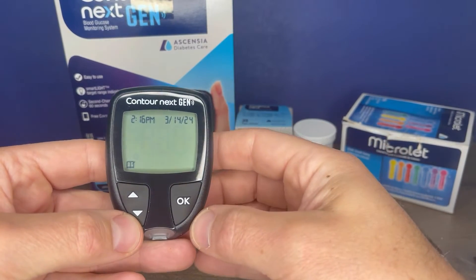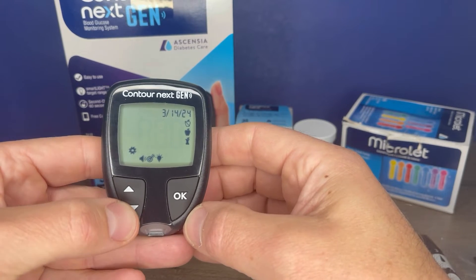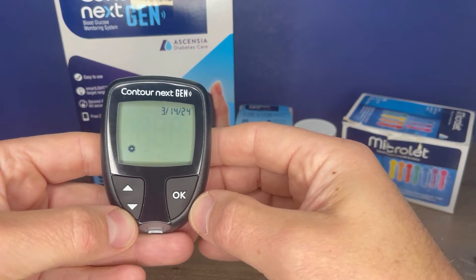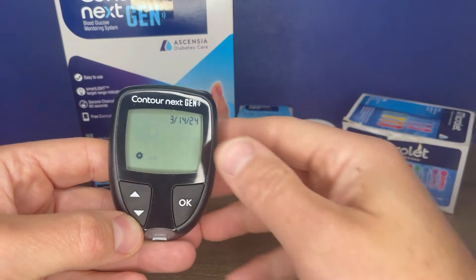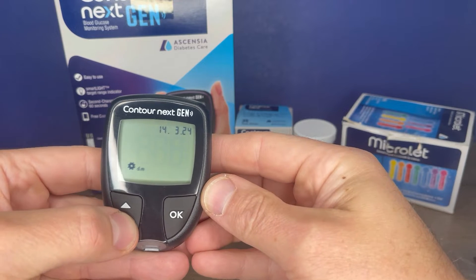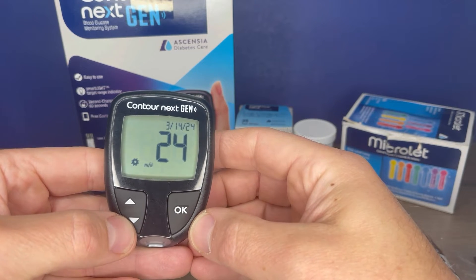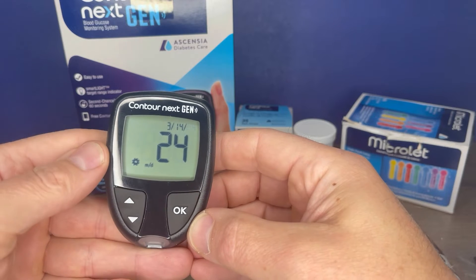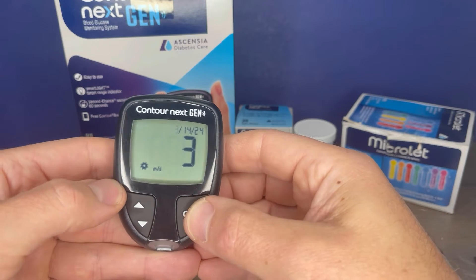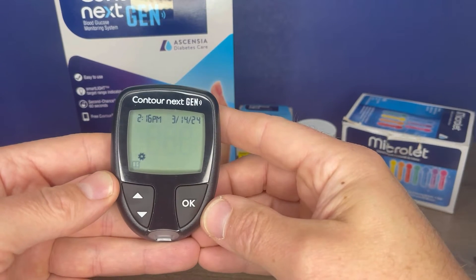If you need to adjust the date, go back into the settings menu with the settings icon flashing and press OK. Press the arrow until your date is flashing, then press OK. It will give you the option to choose month-day or day-month, depending on your preference for how you like the date displayed. Press OK. Then it gives you the option to change the year — use your arrow buttons to adjust. Then on to the month, adjust with your arrows and press OK to get to the day of the month. Adjust and press OK, and you are back at the home menu.